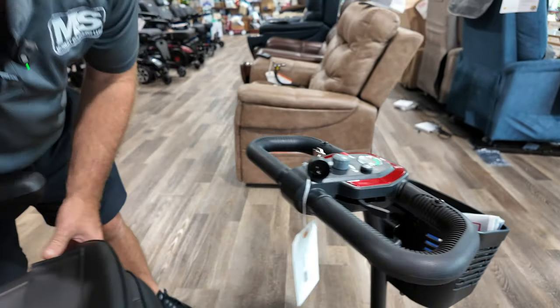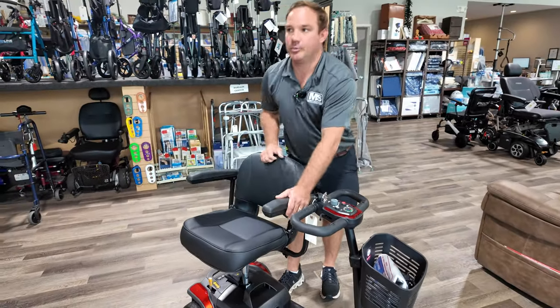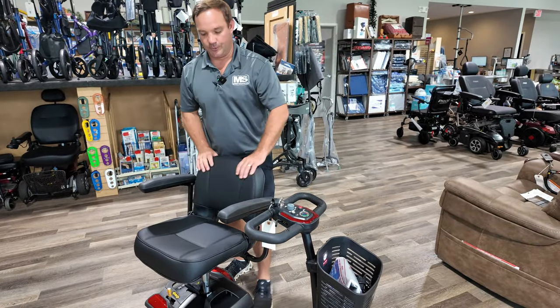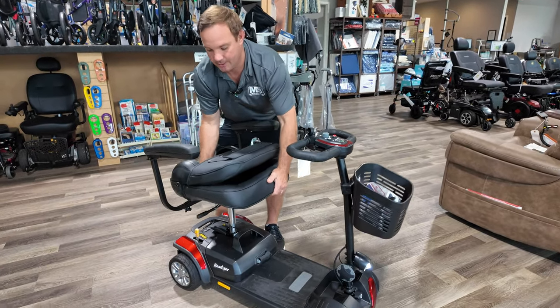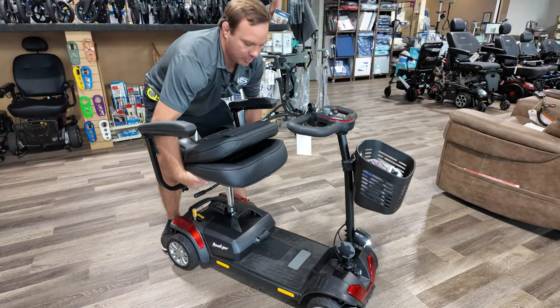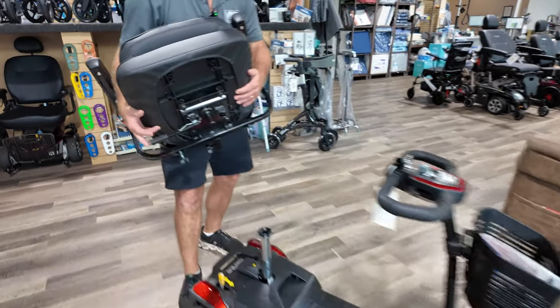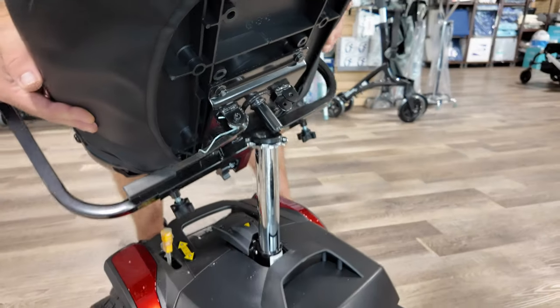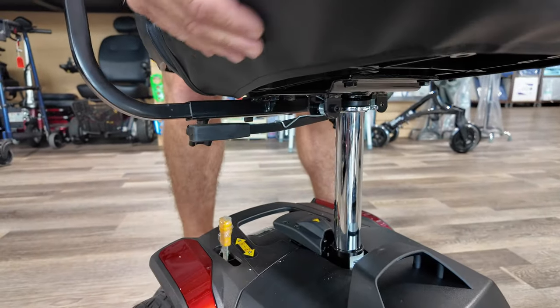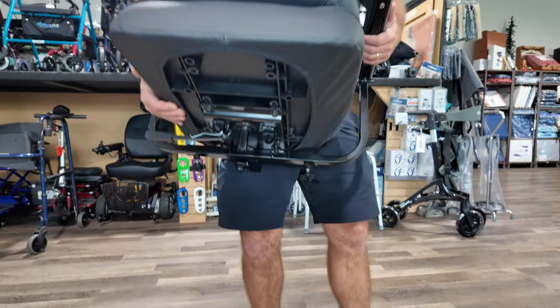The swivel seat is there to help you get on and off the unit, or to swivel when you pull up to a table. I'm going to show you how this comes apart. You just remove the seat — pull it straight up.